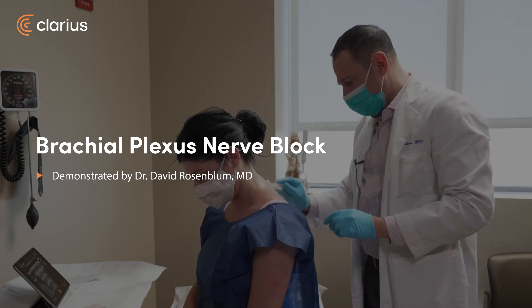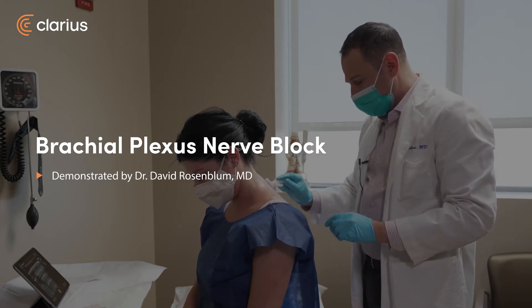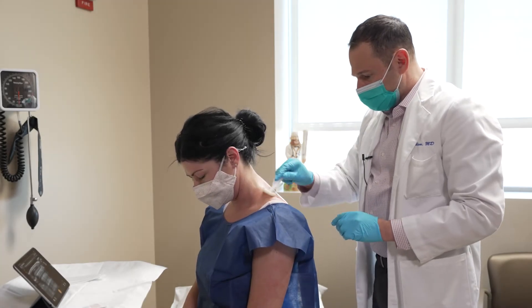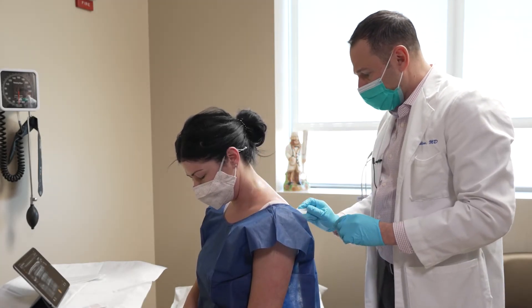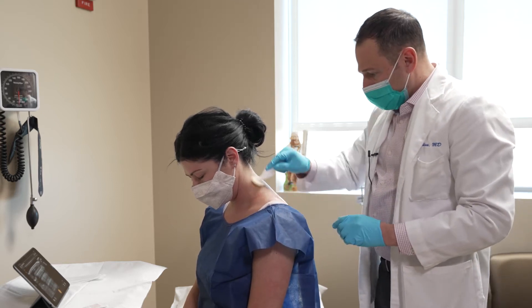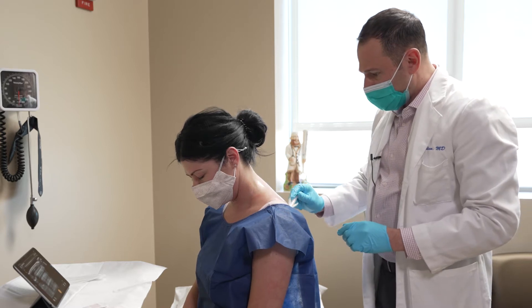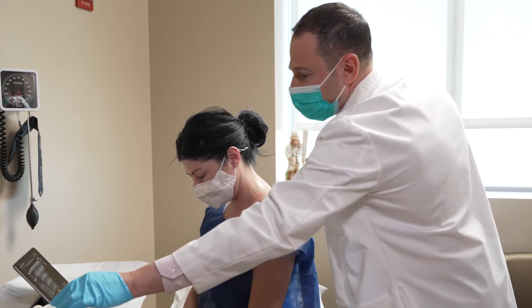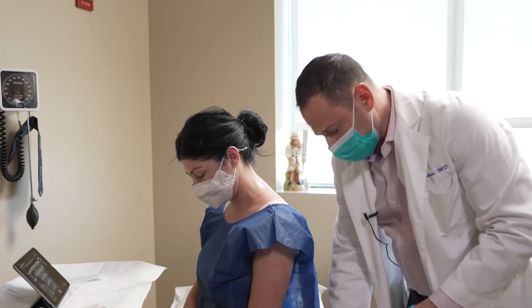I'm going to do a brachial plexus block. This patient has a C8 radiculopathy and she did very well with the first injection under fluoroscopy. It was a selective nerve root block using a fluoroscope and an ultrasound to find the nerve. Today I'm going to repeat that, but I may actually go to the supraclavicular brachial plexus and anesthetize that region.